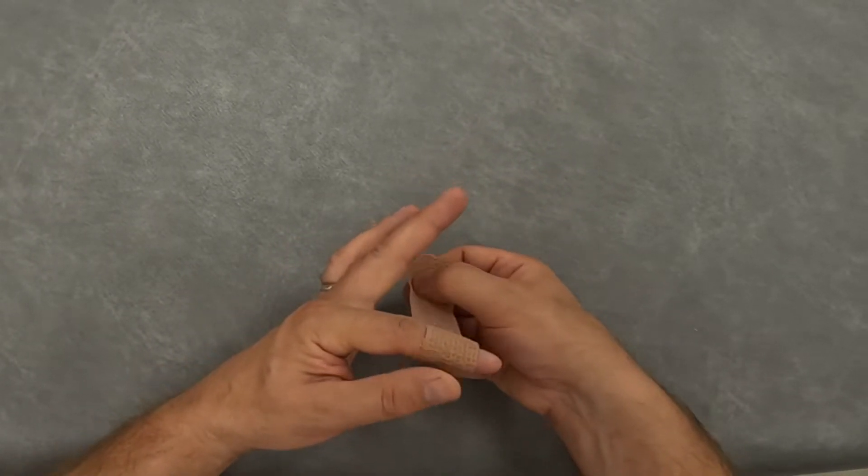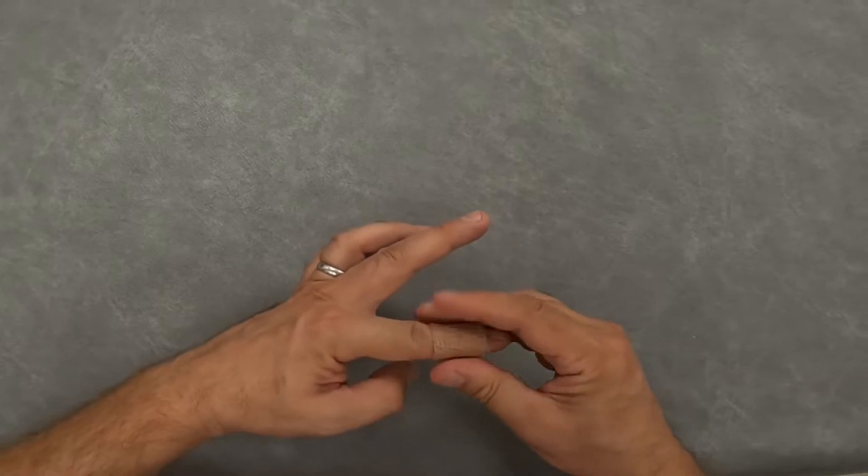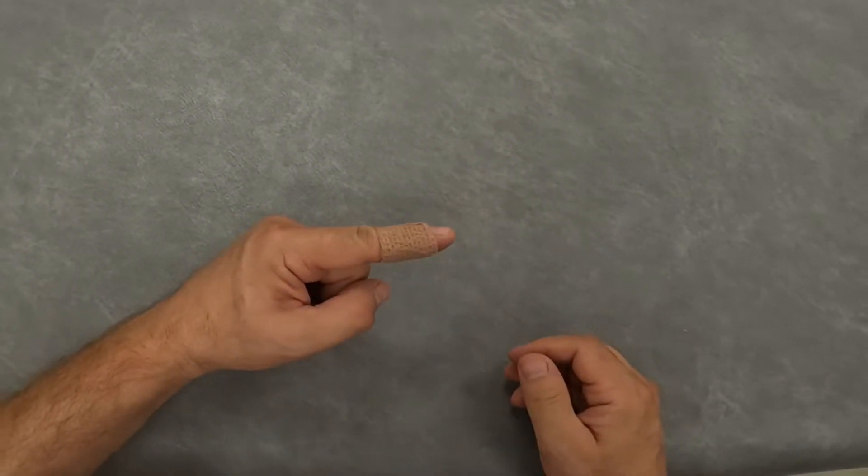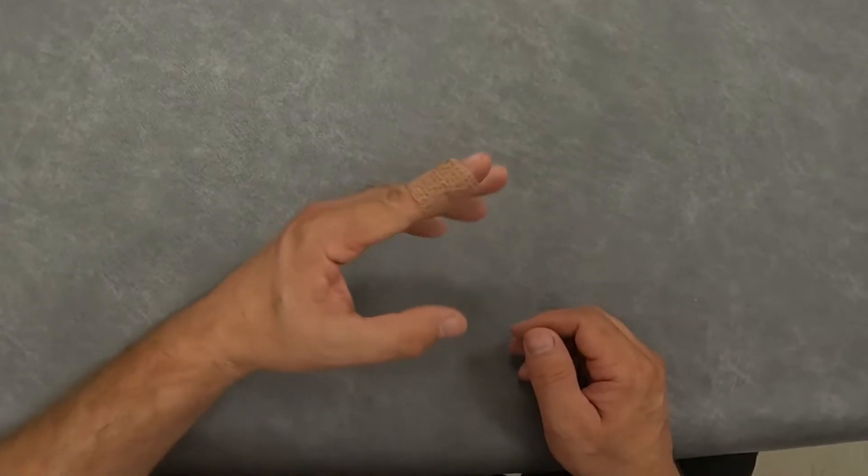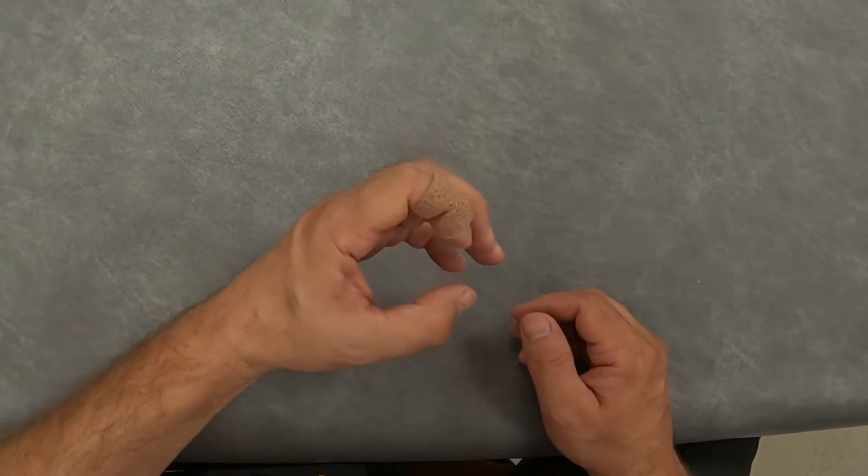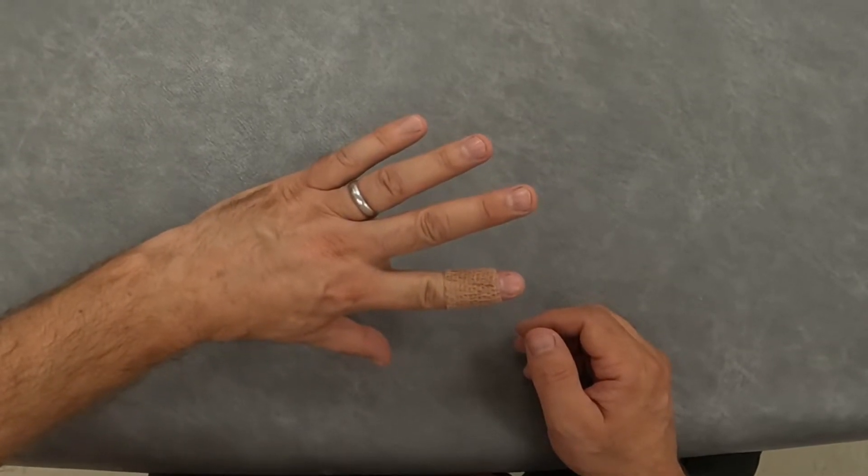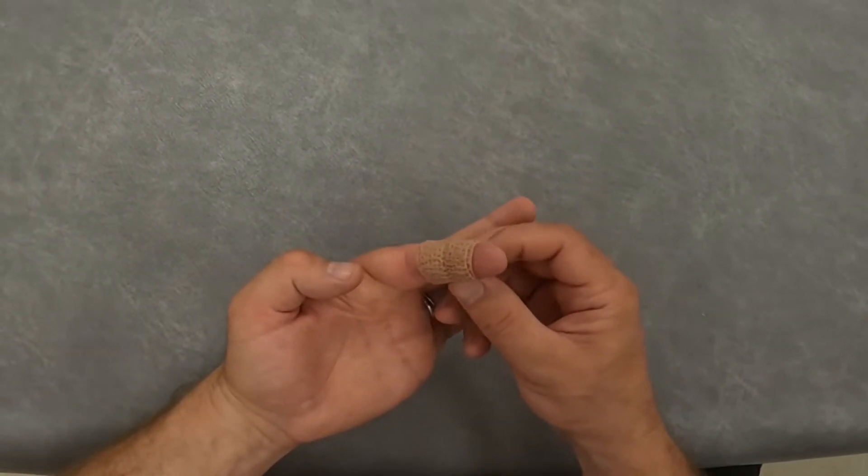It sticks to itself so there's no need for any sticky tape to keep it secure. Once on, you should be able to use your finger fairly normally. It just provides a bit of support and protects against those irritating knocks and bangs that can occur all too commonly when you've got a painful finger joint.